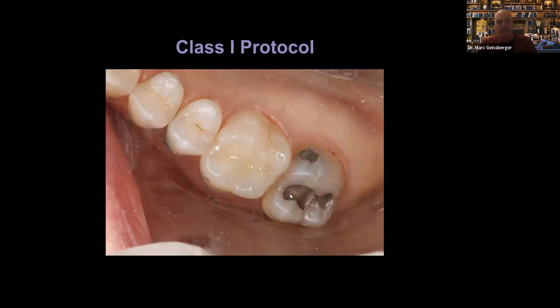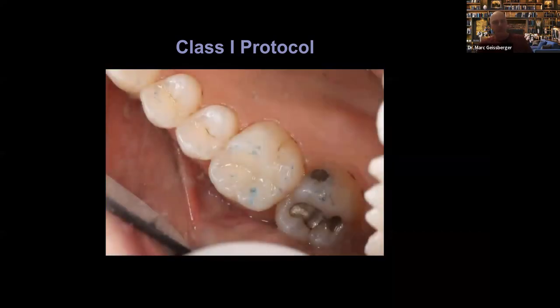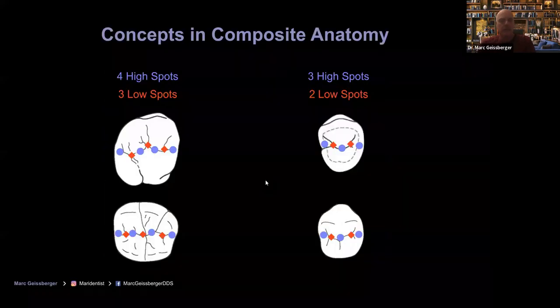So the amalgam was done fairly well, kind of resembles some tooth anatomy. So when you think about that, if you get this right and you keep this triangular ridge and oblique ridge here the same height as this marginal ridge that was intact, and you keep this group of triangular ridges the same height as this marginal ridge, get your central fossa a millimeter and a half below this, generally speaking, in an unworn tooth, anywhere from a millimeter to a millimeter and a half. This one, a millimeter lower than the marginal ridge and oblique ridge, you're going to have very little occlusal adjustment to do.